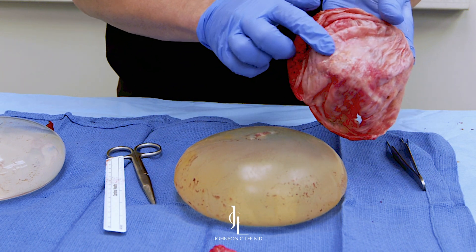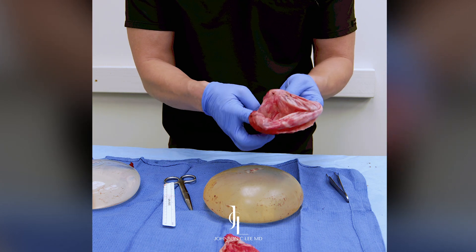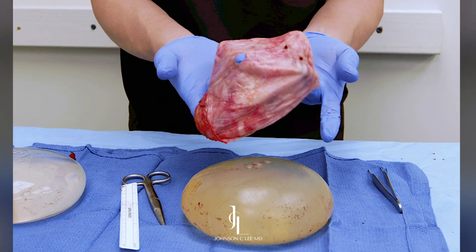There are even little areas of calcification from chronic inflammation, and this little rock-hard stuff is just more calcium all over the place. So that's what it looks like on the inside.